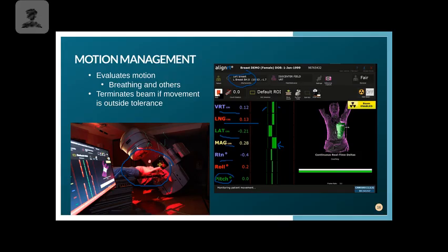So this is like our last thing that we'll do before we image our patient: we will do our motion management while they're on the table and fine tune anything that we can. And then even if we're a little bit out of tolerance, we'll say, okay, well, let's go ahead and image, because maybe what we're seeing on the patient's skin for our marks lines up, but then this is telling us that maybe we aren't quite there. So then if we do our CT imaging or X-ray imaging, when it comes up, we can match and see exactly how far off we are. And then usually once we do that last final shift before we treat the patient, then everything's going to go back into being green. So we're good to go at that point.